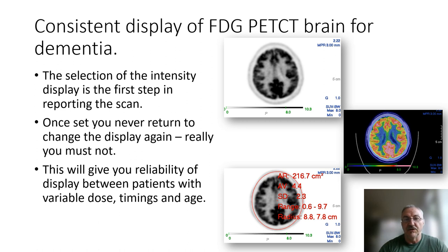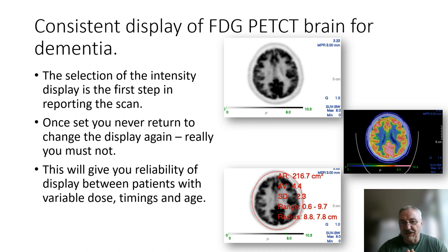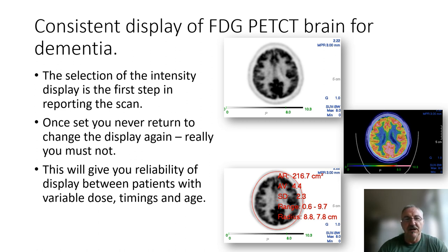The important thing, whether we choose the experiential, the calculation, or the five-levels-of-saturation method, is that before we do any clinical assessment of the brain, we choose this slice, set the intensity, and then do not change it again — no matter how tempted you may be. This will give you a reliable display that is reliable between patients, accounting for variations in dose, timing, age, and blood sugar levels. Many variations can affect FDG uptake in the brain, and this consistent approach lets you look for pathology reliably.